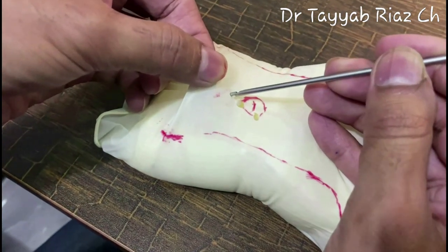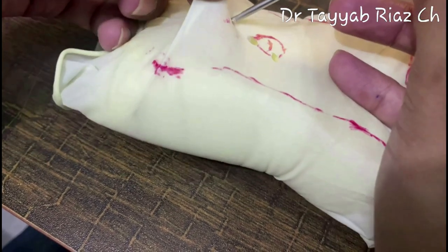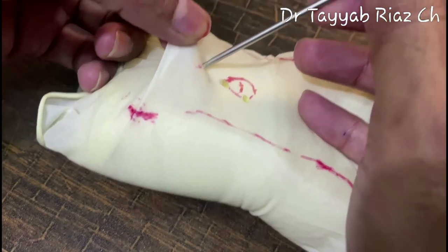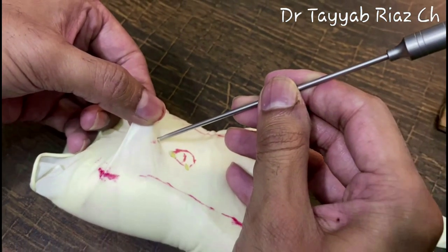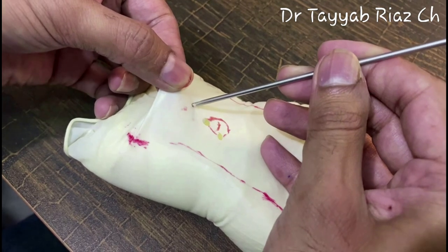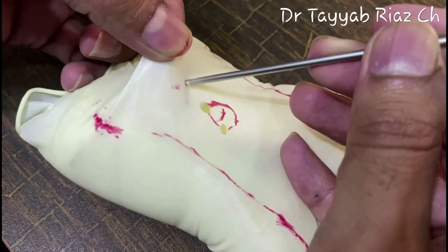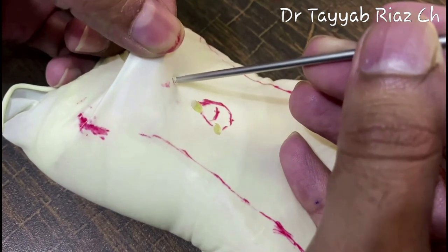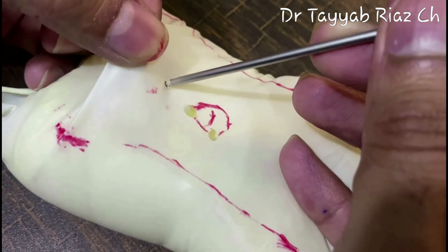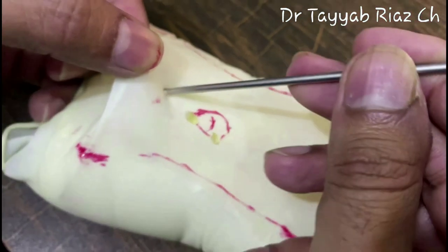Why this 90 degrees angle to the anterior abdominal wall? Because if you enter at 45 degrees, you will get lost into the preperitoneal space, because you are going oblique and the thickness of the abdominal wall that is less in the vertical direction will become more while going oblique. And holding only skin will only add to the vertical distance from the skin to the peritoneum and will also make your entry more difficult.